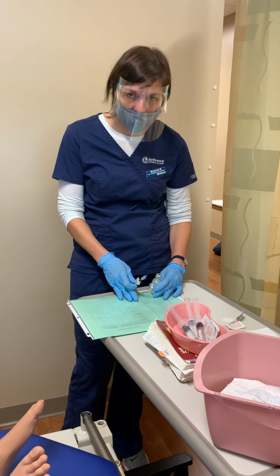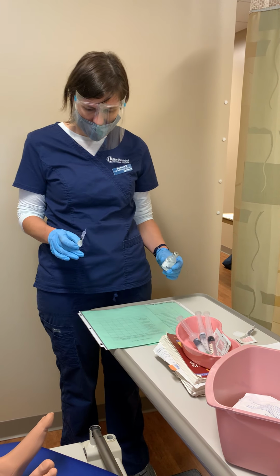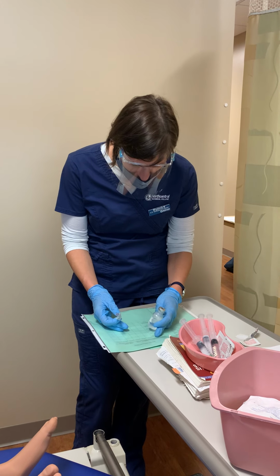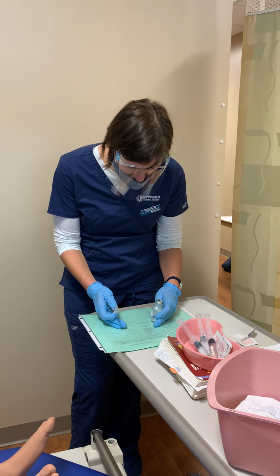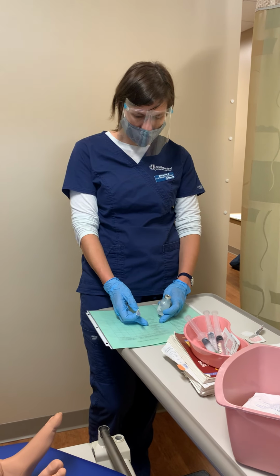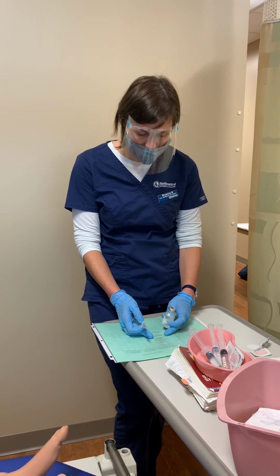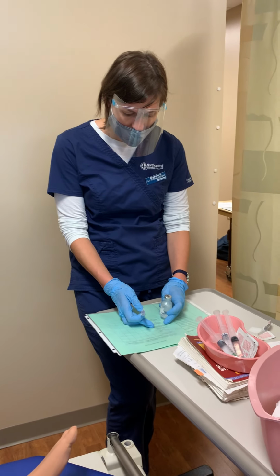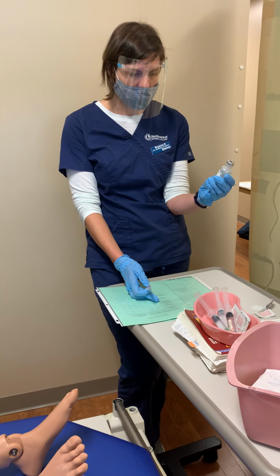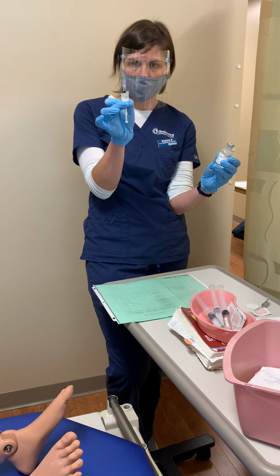Now I'm going to do my five checks 3 times. So I have Frances Christensen, and I am giving her morphine IV push every 1 hour as needed. It's been over an hour since her previous dose, and it's 2 milligram ordered. I have the 10 milligram per 1 ml, which equals out to 0.2 ml.